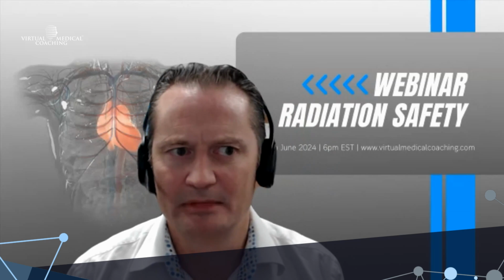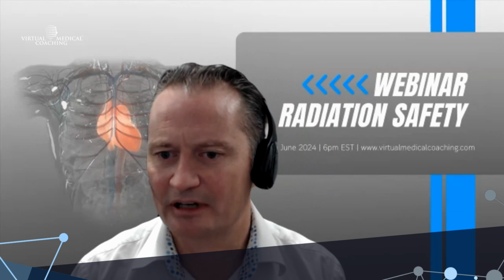But unfortunately, in this situation, it's counterintuitive. The patient becomes the source. Therefore, we need to show this learner what's going on. And the way we did that was we colored the radiation. We did a number of years of Monte Carlo simulation, where we had to simulate every photon in every possible position in the operating theater. That's a way of heating the environment in the office over winter, because you've got such huge GPUs spinning without needing to turn on the air conditioning.